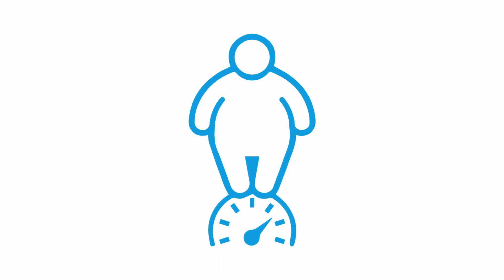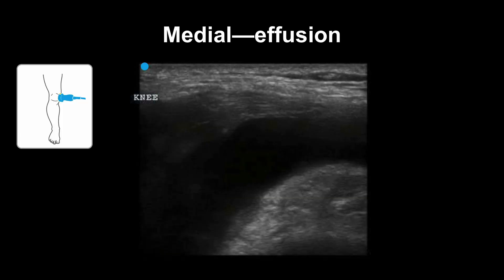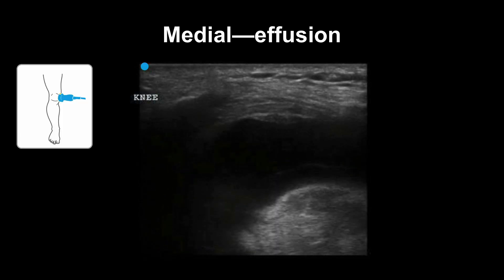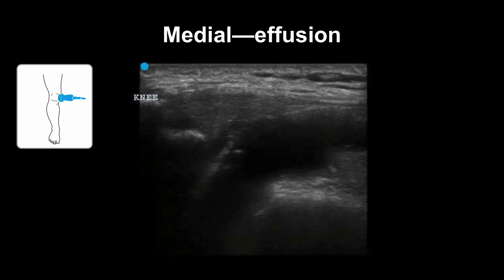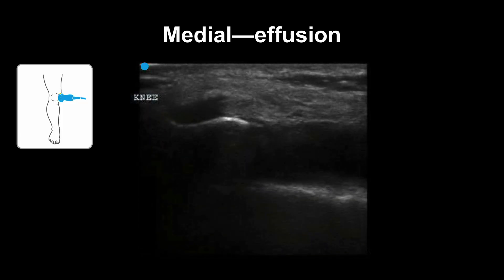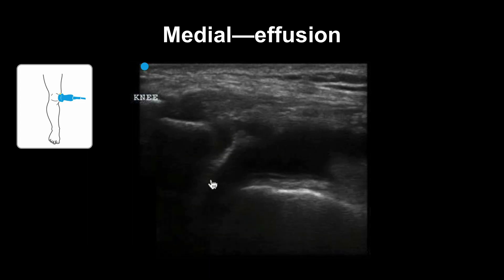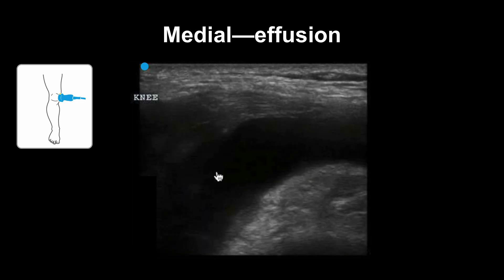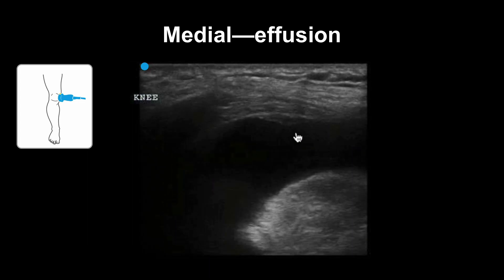How do you decide where to go when there's no landmarks? You can use ultrasound to find the biggest pocket of fluid. Here is an example of an effusion from the medial approach. The fluid appears hypoechoic and without any edges — it's just filling this space here.